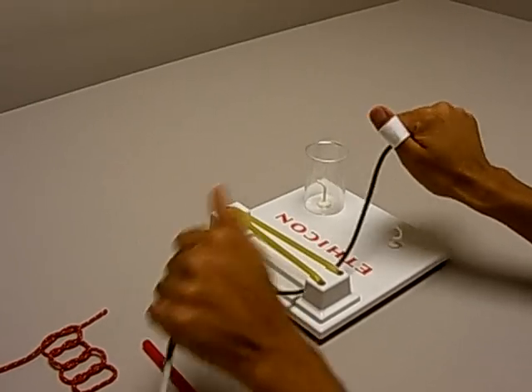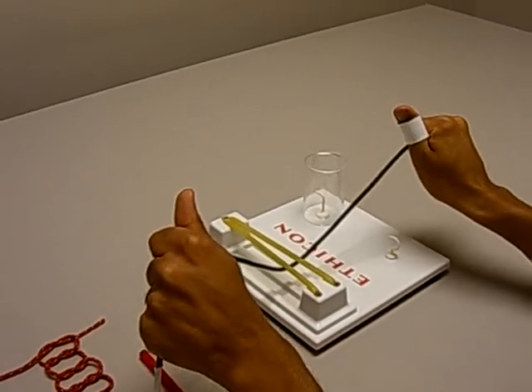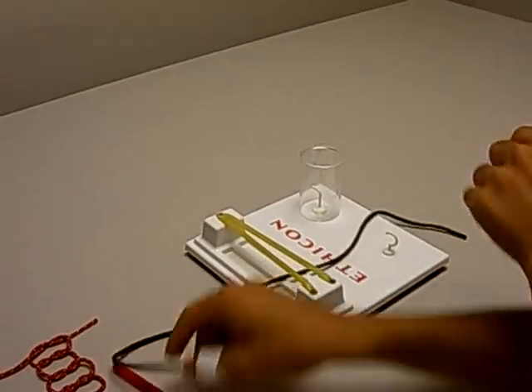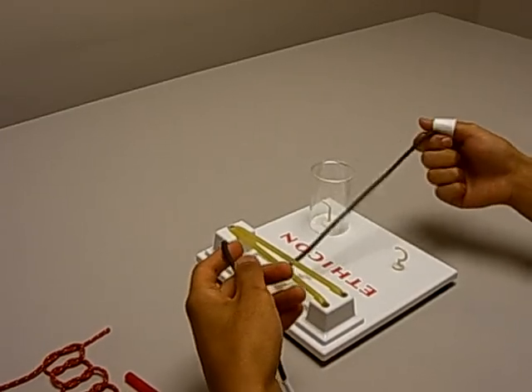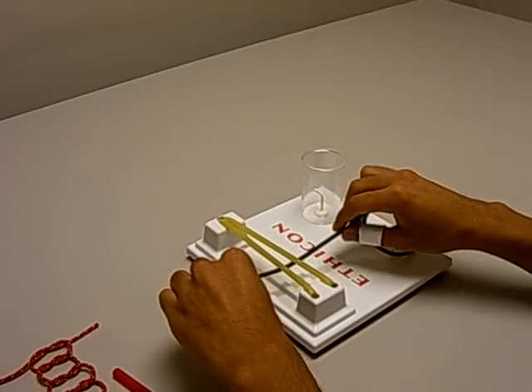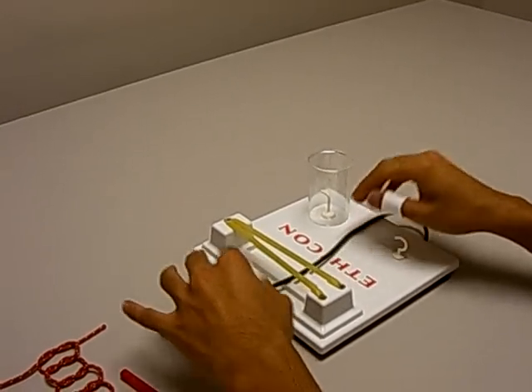One more important thing: don't let go of the string. Always keep them in your hand, because if you let go you can accidentally grab the wrong string. So once you have a string in your hand, keep it there.